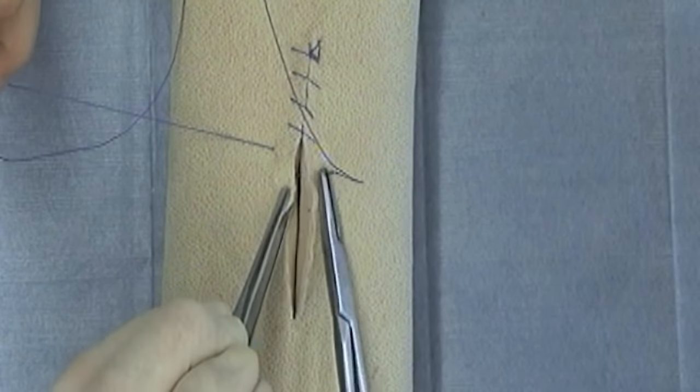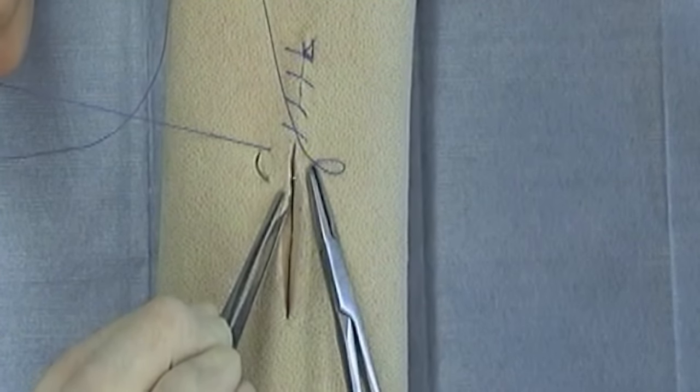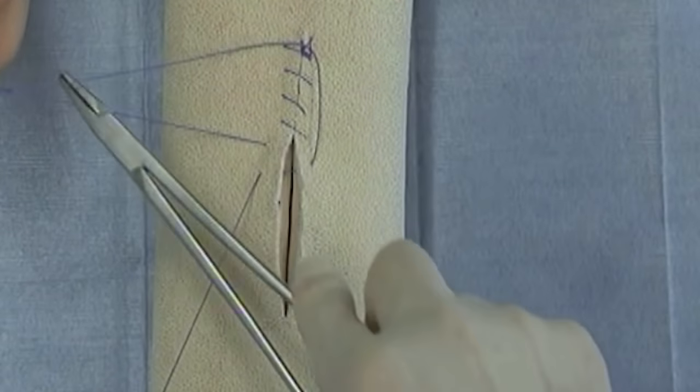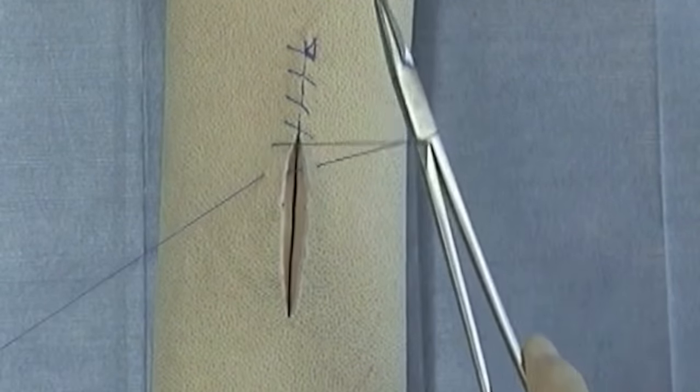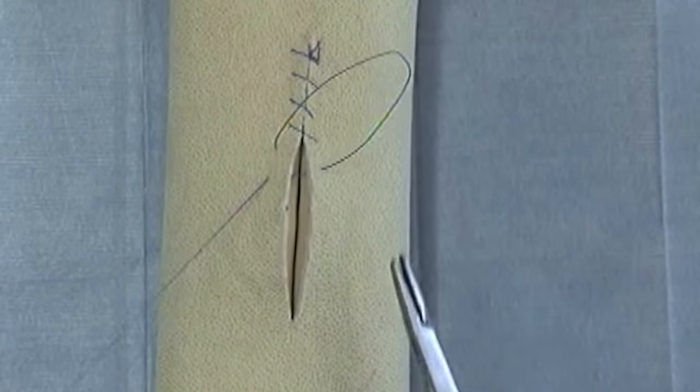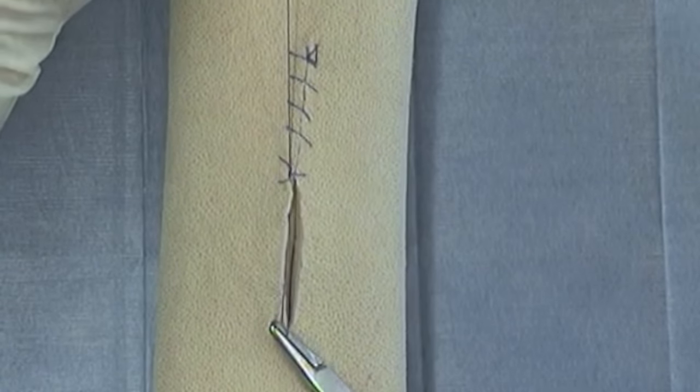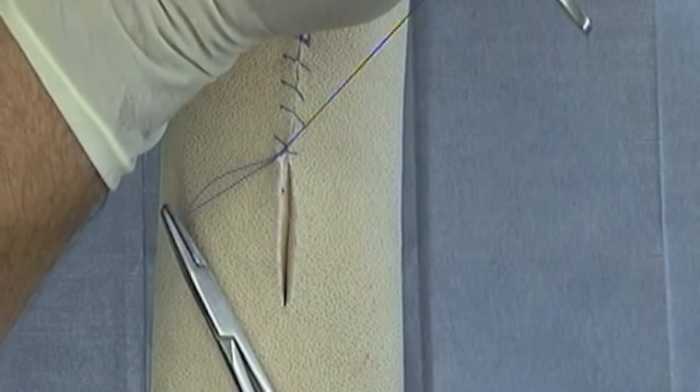Now if I wanted to end the pattern here, there are two ways that this pattern can be ended. One is to simply tie to your last loop of suture, which is perfectly acceptable.